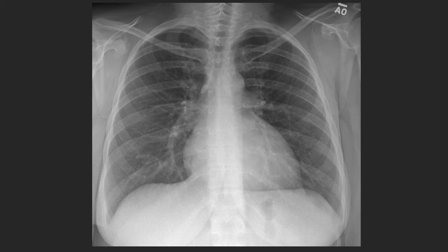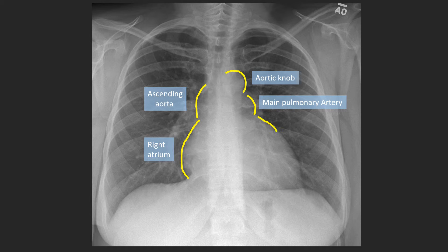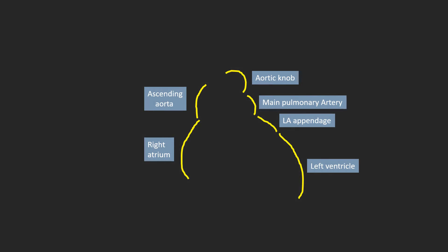With so much overlap, we have to decipher which structures we can see as a contour. On the right, the right atrium forms the first contour, and above it the ascending aorta forms the next. On the left side, the first bump is the aortic knob representing the aortic arch. Just below it is the main pulmonary artery. The bump below that reflects the left atrial appendage, and finally the majority of the left heart border is formed by the left ventricle.